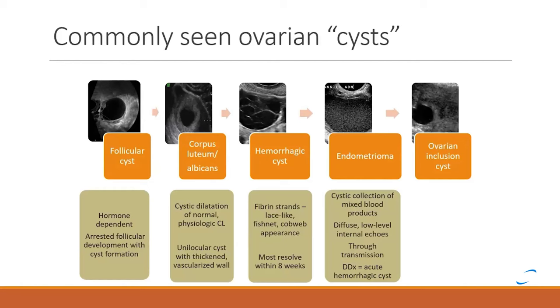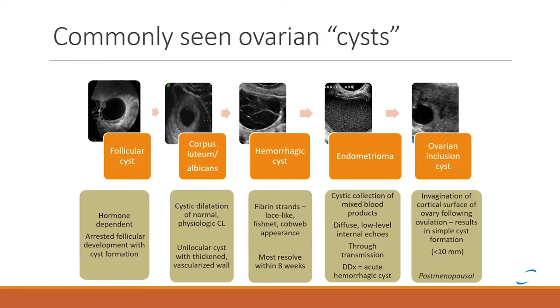The endometrioma is a cystic collection of mixed blood products and is very characteristically described as having diffuse low-level internal echoes. As you can see throughout this cyst, it has a ground-glass appearance and does have through transmission. Sometimes there is overlap between a hemorrhagic cyst and an endometrioma.